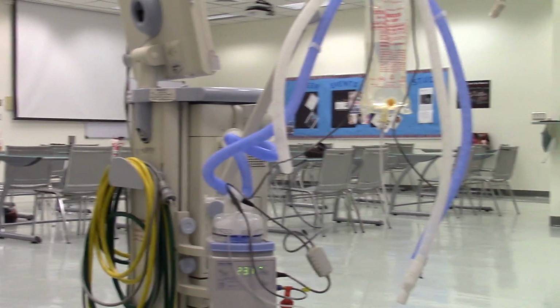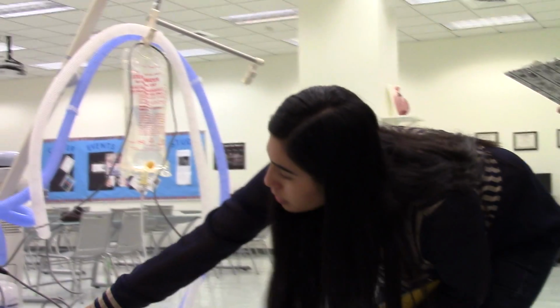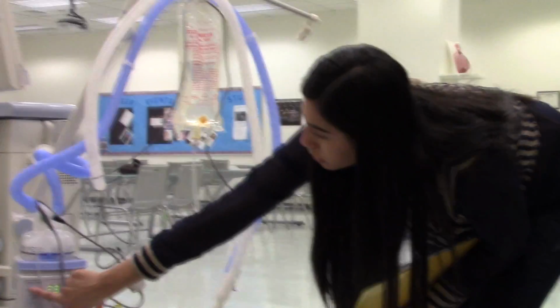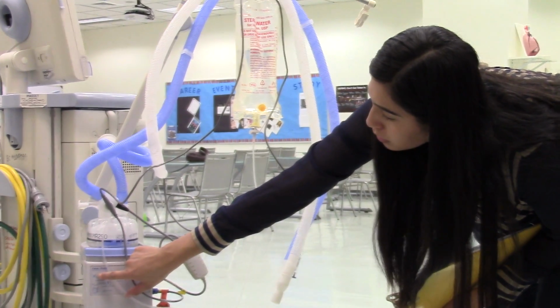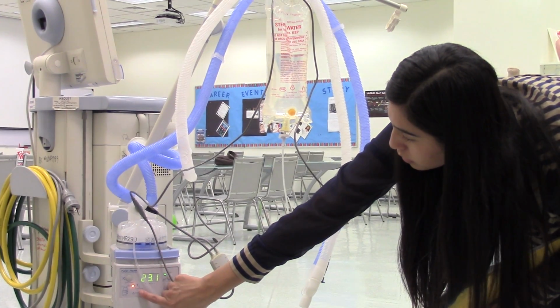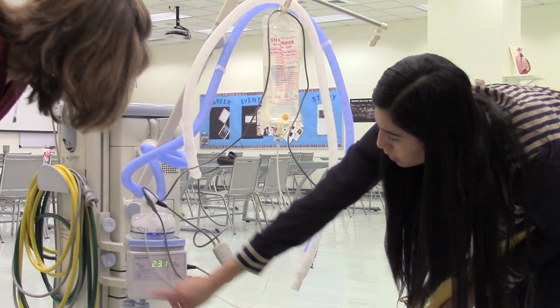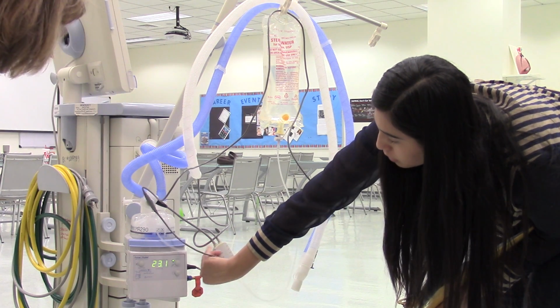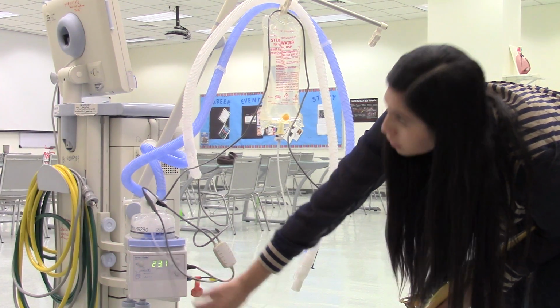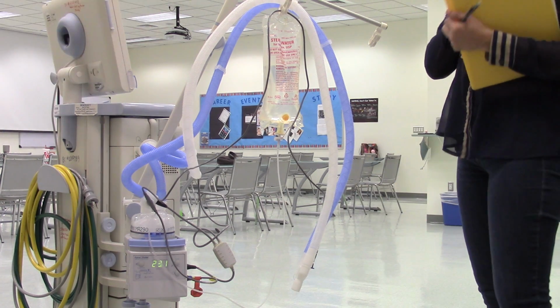Okay. And it says locate the alarm silence. Okay, you're looking for a bell with a line through it? Oh, here it is. Yes. So I gotta push it. Press and hold. Is that the right way or no? It's showing. It has a little orange button. Yeah, I think it's telling you that the temperature hasn't been reached yet, because it's still warming up. Plus, we don't have any flow going through the circuit.